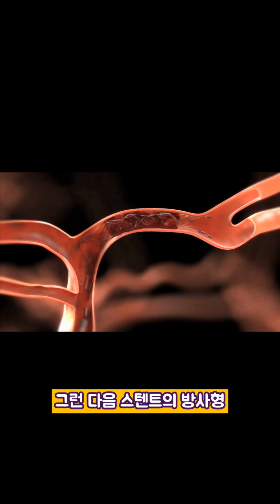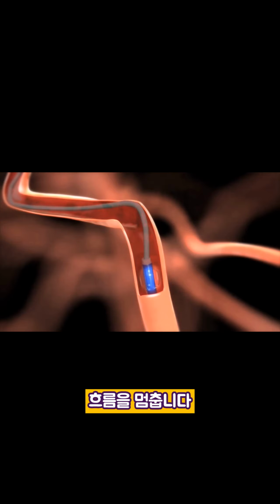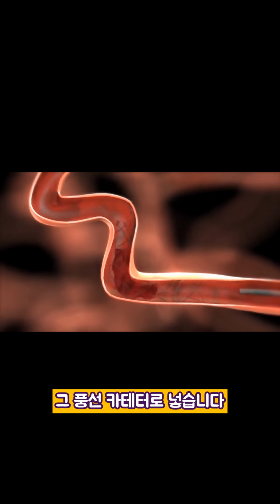We then give it about 5 minutes, allowing the radial force of the stent to open up outward and allowing the clot to extrude within the lumen, or inside, of the stent. After the 5 minutes is over, we inflate a balloon in the carotid artery in the neck, which arrests flow, and then we pull back the stent retriever device with the clot entangled inside it into that balloon catheter.